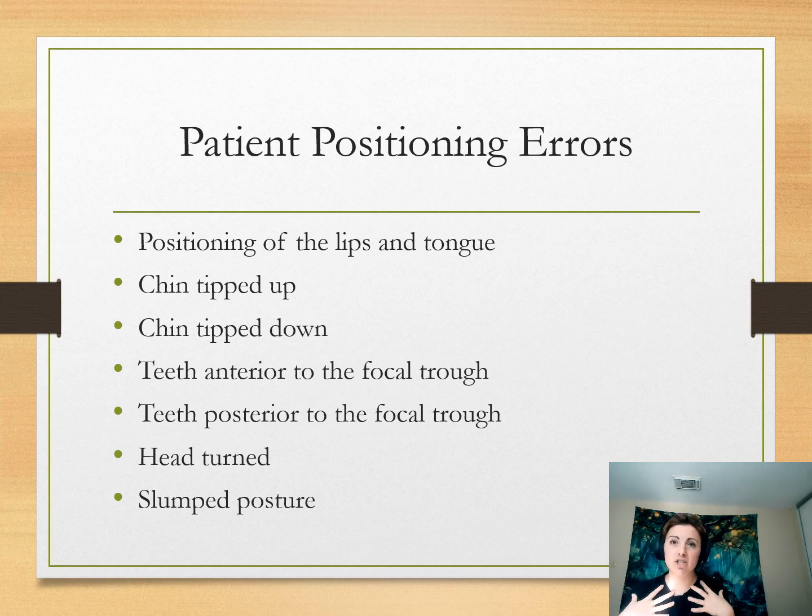I'm terrible. I have such terrible posture. And so I also have this problem, but you really want to make sure that they go in there and they stand up straight and they put their shoulders down. Sometimes, especially older patients, they're kind of permanently slumped. They're like little hunchbacks, not humpbacks, my goodness. And so they'll be there in a crook.